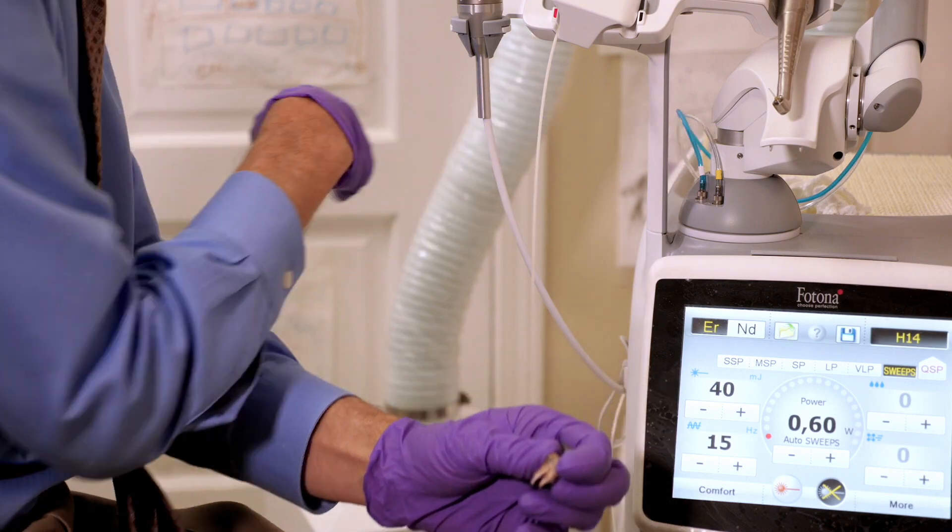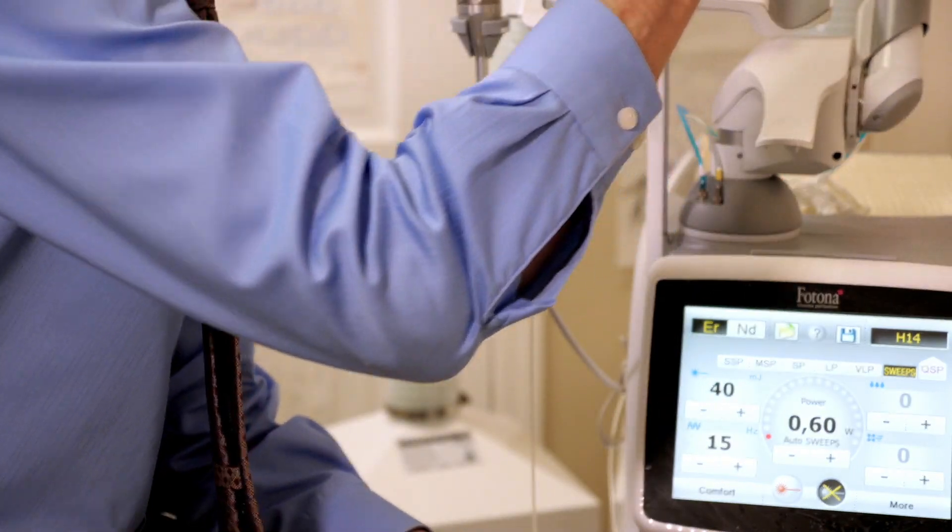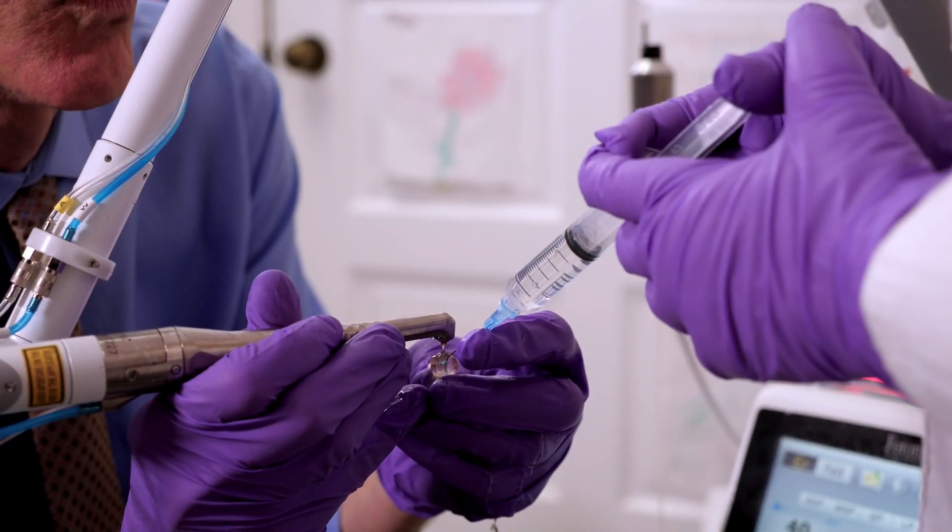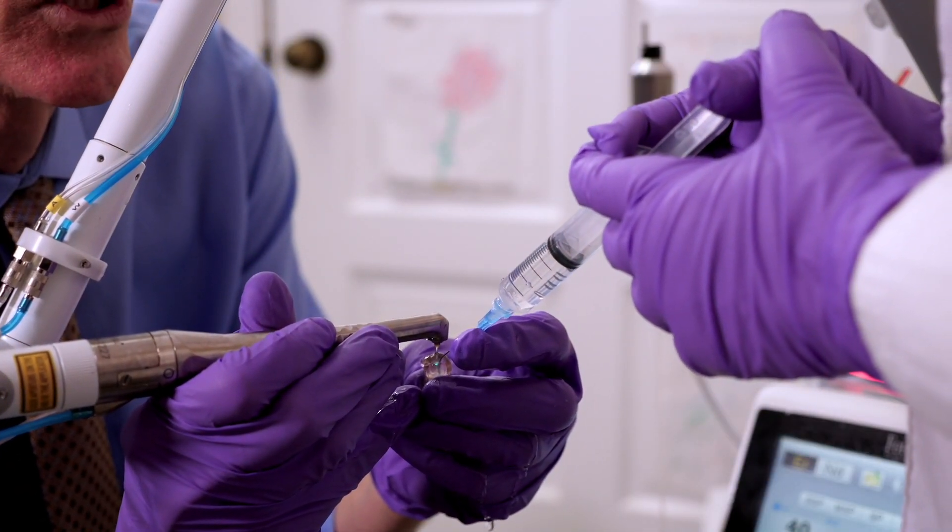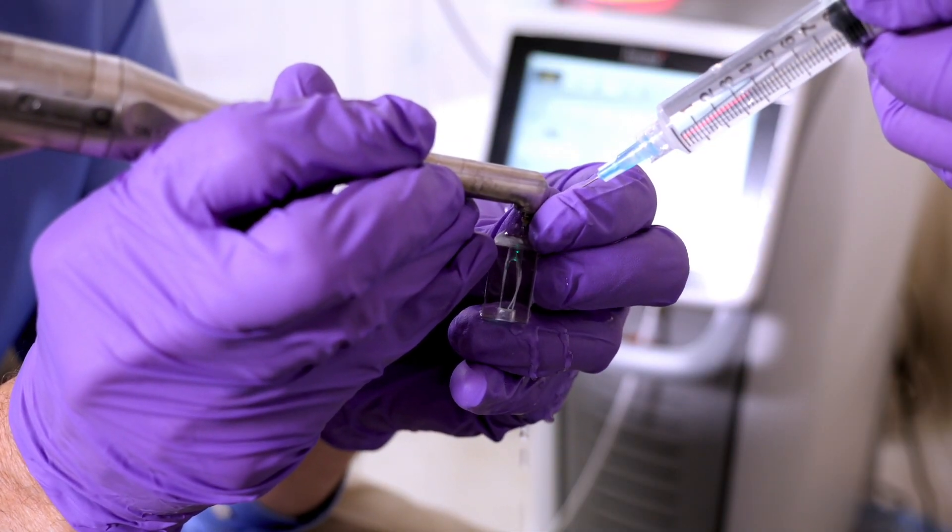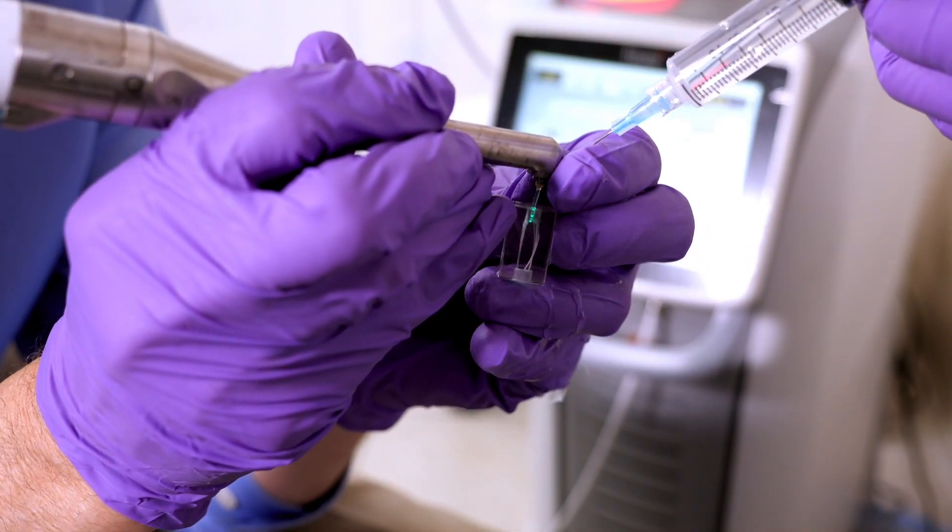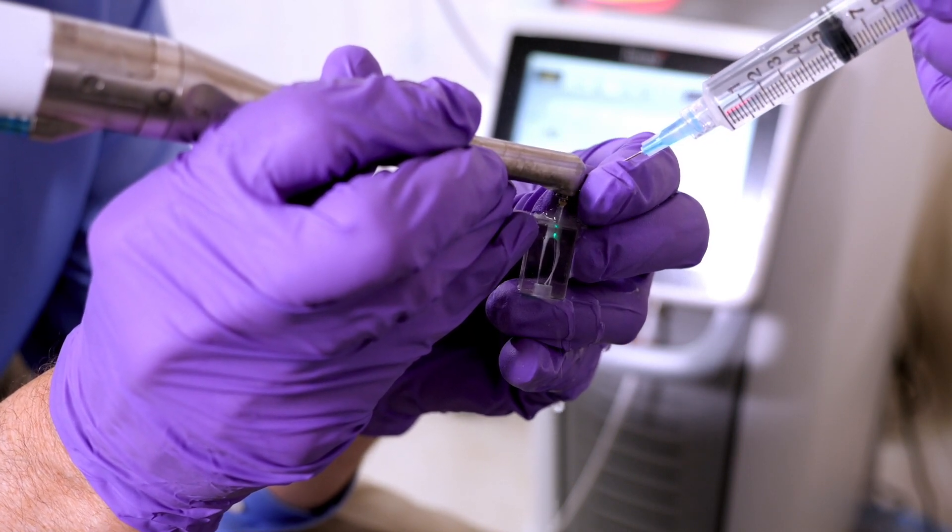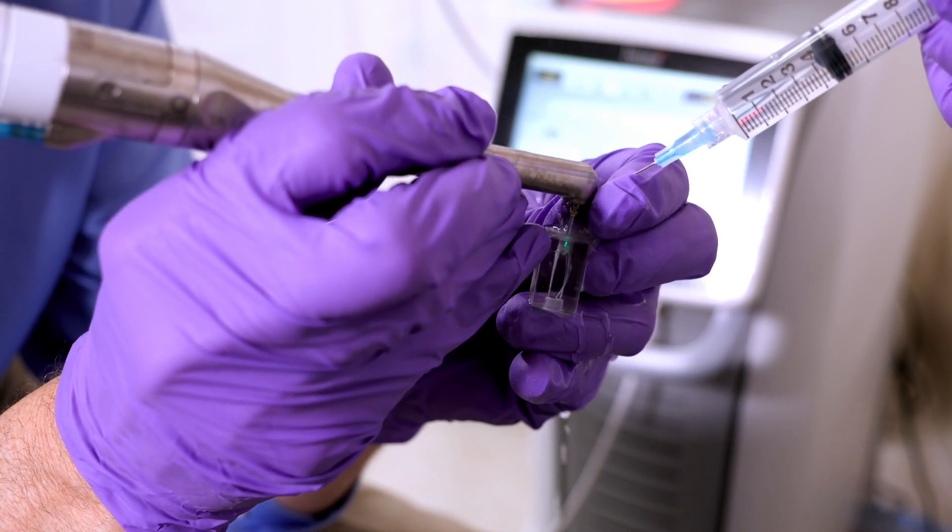So what I'm going to demonstrate is how the erbium laser works to actually clean out teeth. We flush the tooth with water, different types of solutions like ozone water and a chelator. And the laser hyper-excites the solution, activates it with photon energy and light so that it actually penetrates into the tooth.